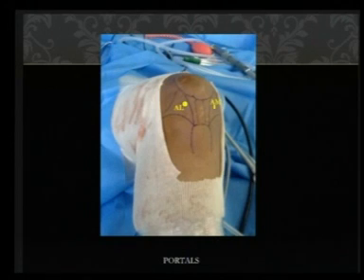If you make an anterolateral portal, the anteromedial portal can be closer to the patellar tendon and slightly higher, and that could be your viewing portal. A lot of surgeons use that as a viewing portal. Some surgeons even go trans-tendon, through the patellar tendon, to view the femoral condylar notch for the femoral tunnel, and make an accessory or far anteromedial portal.